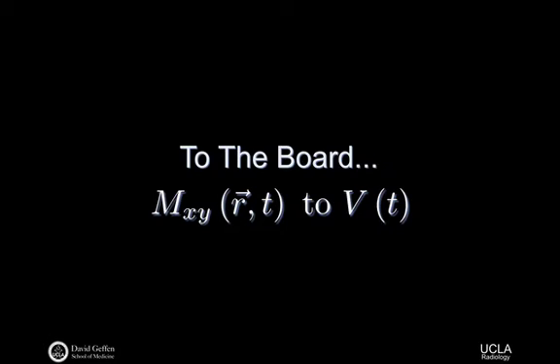It's not simple, per se. It depends on something like our initial condition, some decay of the magnetization during the time in which we're actually sampling it, the frequency that we care about, and then some cosine terms here that link us to the spatial encoding.